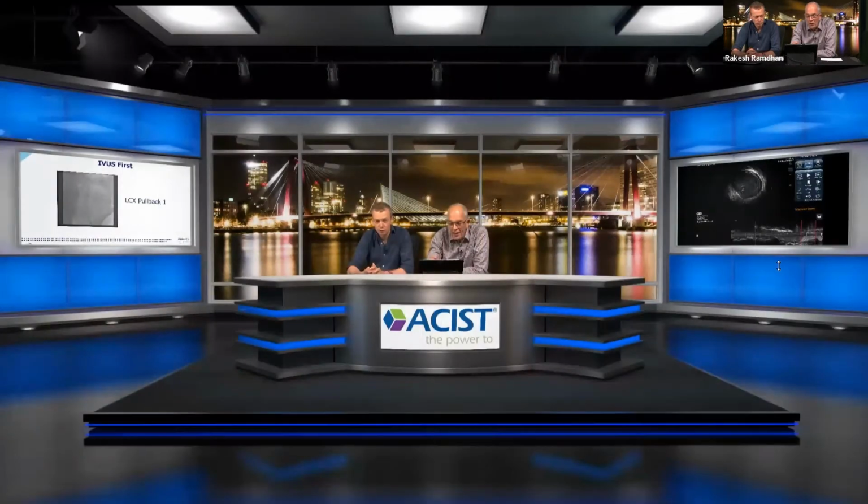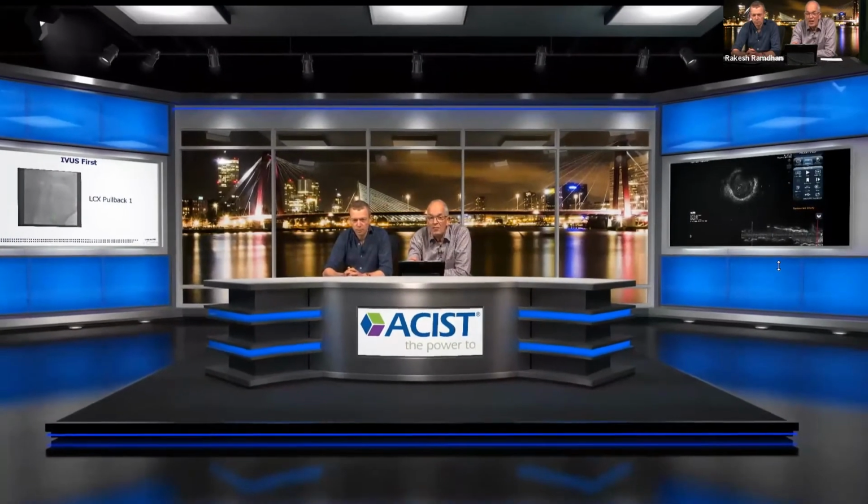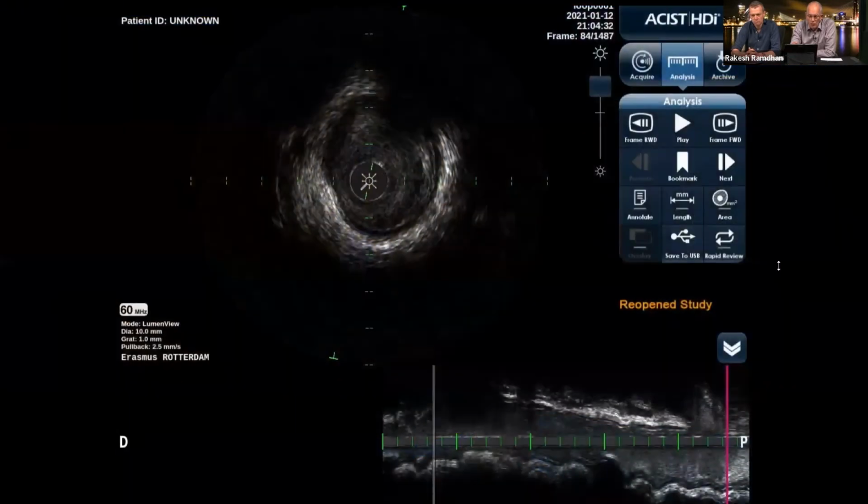Well, we can make the part on the right bigger. Just for your orientation, remember it was easy to pass with a wire through this closed vessel, because you saw the vessel was closed with a wire, and then with the IVUS catheter they went in.